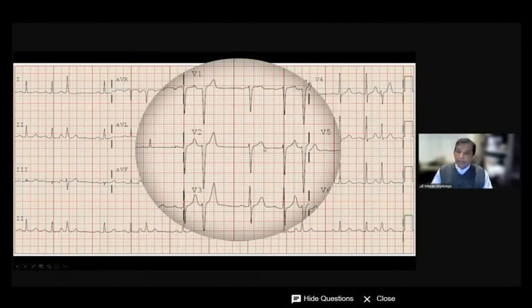Now, is it my imagination? Well, I argue back and say, look at the following QRS. That QRS is different. And then I argue back and say, yes, there must be a hidden P wave here, conducted. Now, this part in this scenario, unlike the previous one, is conducted through the right bundle, but the left bundle is slow. You get a left bundle branch block aberrancy here.